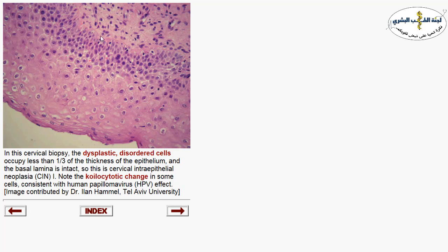Here you can see minimal dysplasia confined to the lower third of the cervical epithelium. Only the lower third is affected by dysplastic changes including hyperchromasia, irregular nuclear membrane, and nuclear disarray. The cells are not respecting each other, with loss of streaming. These dysplastic changes confined to the lower third represent cervical intraepithelial neoplasia grade one.